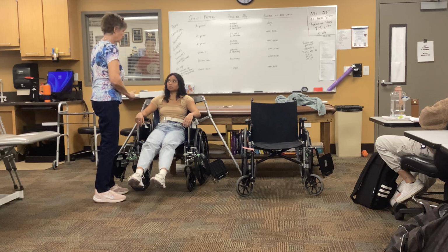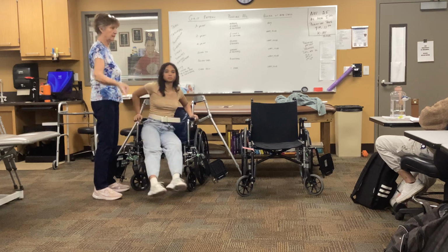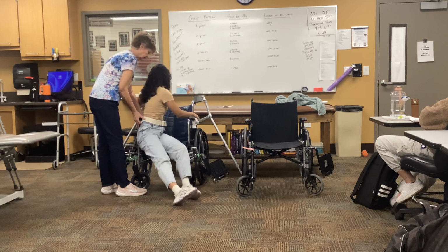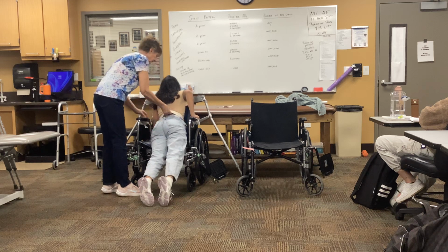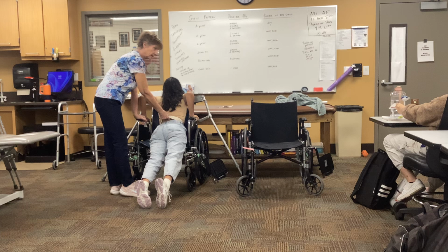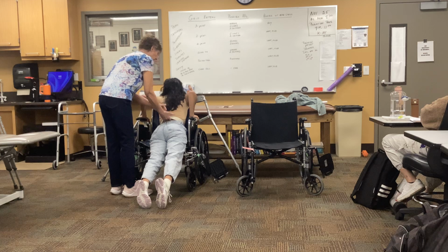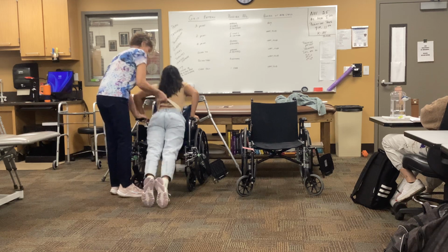Now what you're going to do is turn either way in the chair, just like the up and down method from the floor. Go ahead and turn all the way around and get your legs straight out behind you, so you're kind of resting. There we go. Hands up on the armrests. Sometimes you'll hear the term jackknife: you push up really hard and fast with your arms, your back, and your bottom to stand up. Don't bend your knees, don't use your legs. Okay. 1, 2, 3, up.